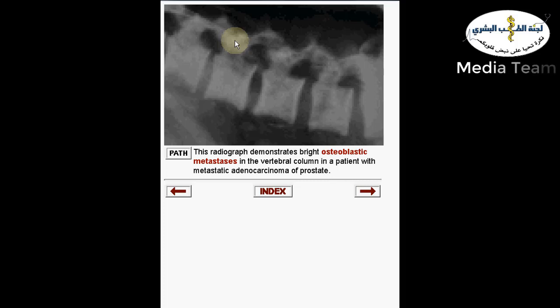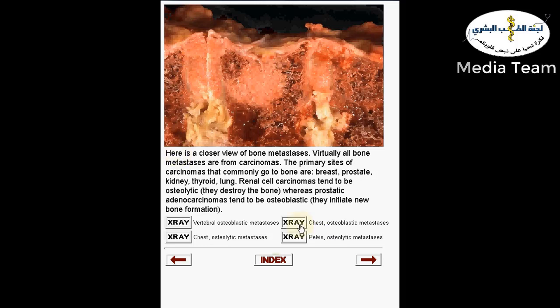But usually the bone appears gray under radiology. When it's very white in an area, that means there's an osteoblastic lesion. When there is a lytic lesion, an empty space, that means there is some lesion that's causing destruction in that area. If you look carefully at this vertebra in the center, there is a whitish nodule. It's very white compared to what bone should be. So this is an example of osteoblastic mets to the vertebra in a patient with prostate cancer.